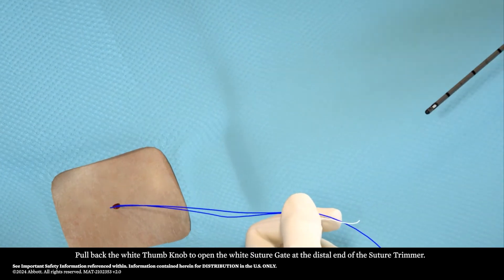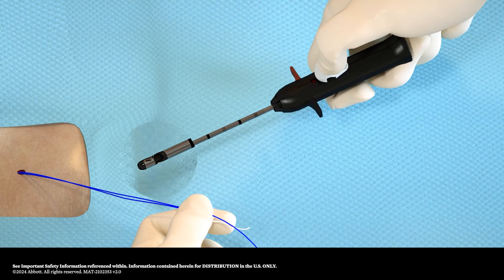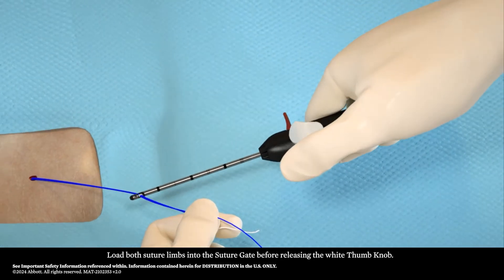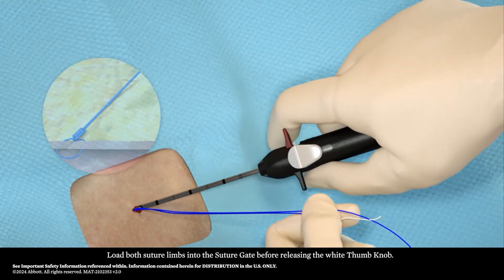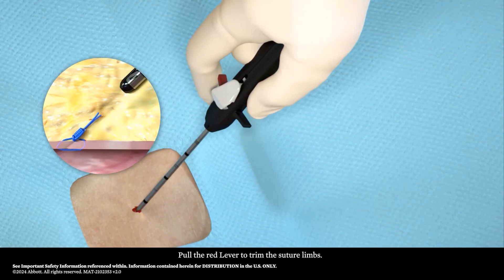Pull back the white thumb knob to open the white suture gate at the distal end of the suture trimmer. Load both suture limbs into the suture gate before releasing the white thumb knob. Pull the red lever to trim the suture limbs.